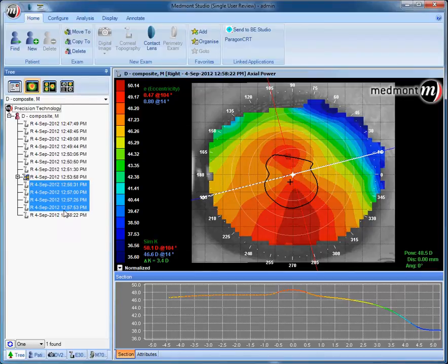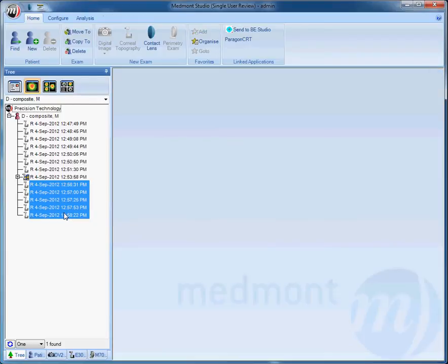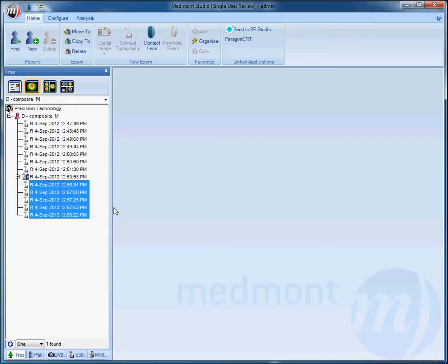Nasal, temporal, inferior, superior, superior nasal, inferior nasal, inferior temporal, and superior temporal. You can take more than five images if you desire to make sure that you're getting 100% of the placido hitting 100% of the cornea.